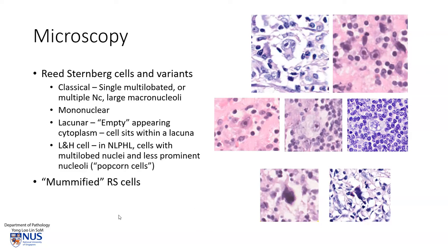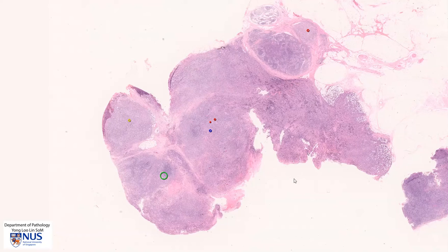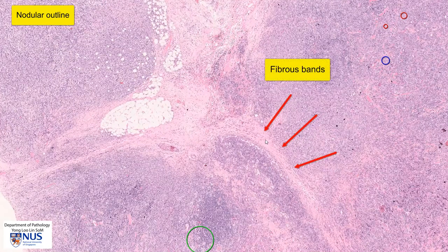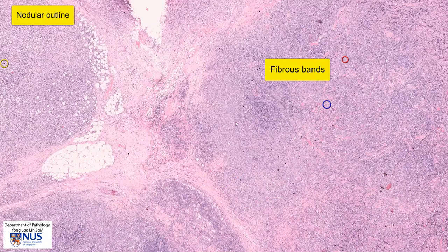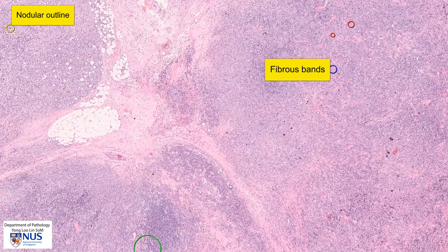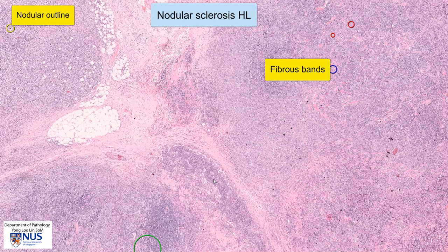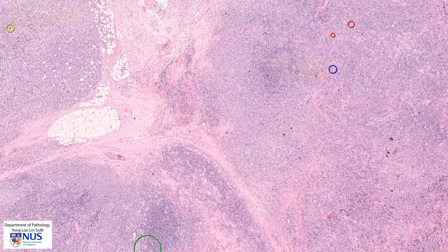Let's go back to our microscopic slide. At low magnification, we can see that this lymph node has a somewhat nodular outline, and in between the nodules we can see pink fibrous bands. There are fibrous bands between the nodules, so we have areas of nodular architecture and sclerosis. Hence, this is the nodular sclerosis subtype of Hodgkin lymphoma, one of the four patterns of classical Hodgkin lymphoma.